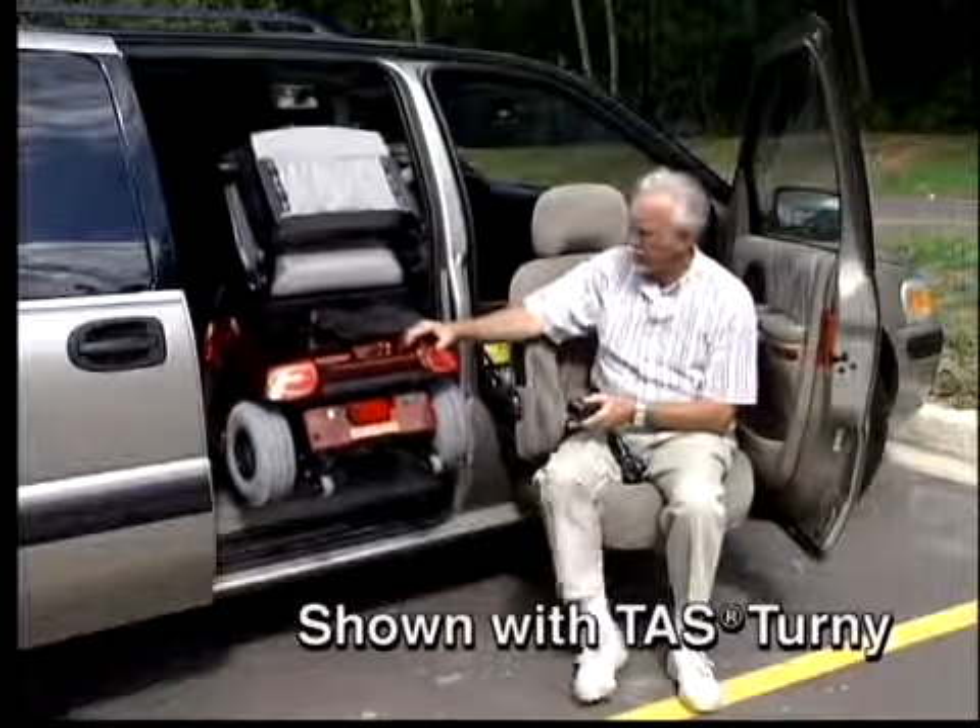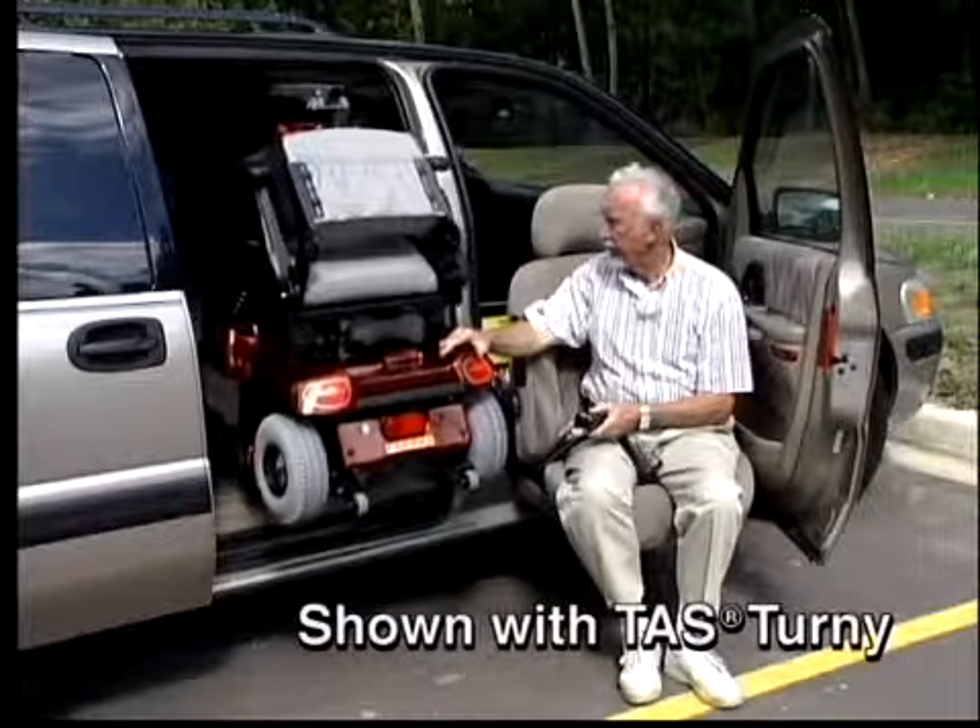This lift provides complete freedom and independence to anyone who cannot ambulate but can transfer into the van.